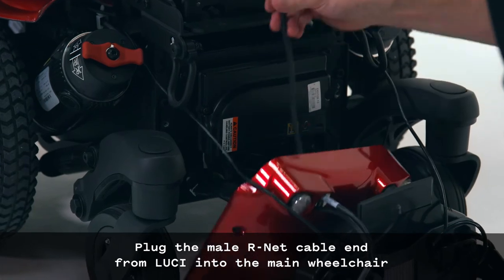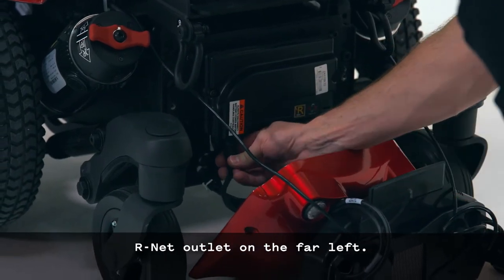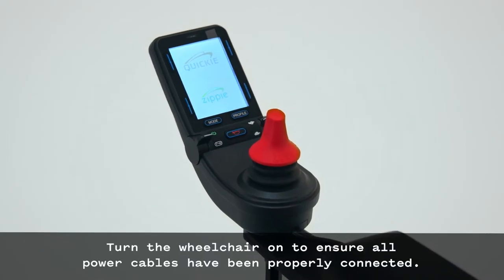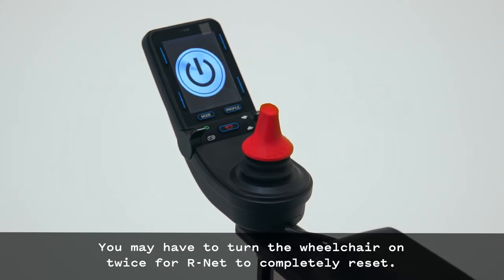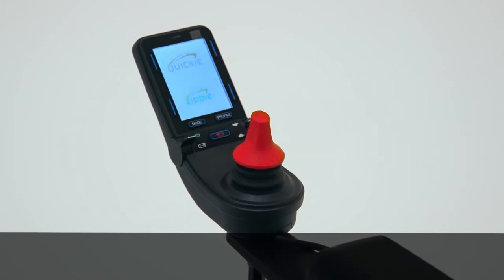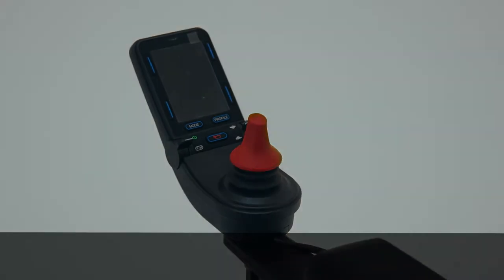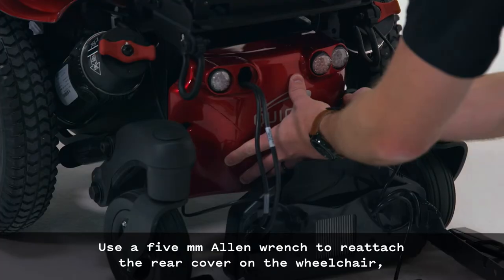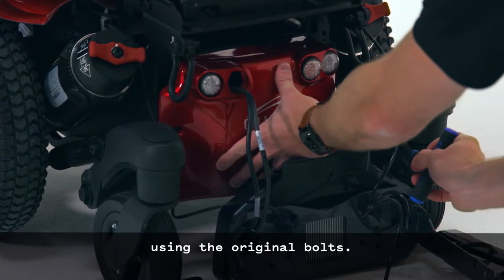On the back of the wheelchair, unplug the main R-Net cable on the far left and plug it into the female R-Net cable end on Lucy. Plug the male R-Net cable end from Lucy into the main wheelchair R-Net outlet on the far left. Turn the wheelchair on to ensure all power cables have been properly connected. You may have to turn the wheelchair on twice for R-Net to completely reset. Then turn off the wheelchair.